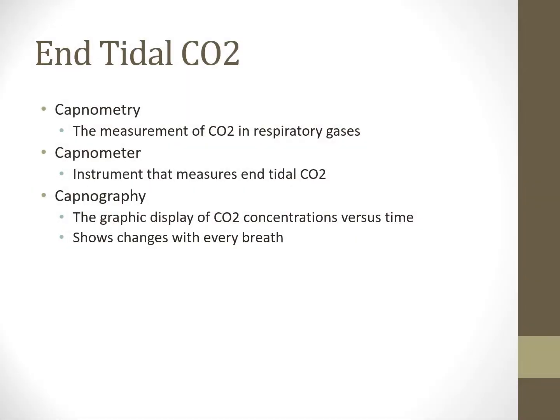Okay, so enough of pulse ox. End-tidal CO2, this is a favorite category of mine. This is a very underutilized and very underrated area of respiratory care. This is a very important area for us to expand and to know what it means. Very few RTs out there understand not only what end-tidal CO2 means to them, but how to use it to benefit their patients more effectively. And so I'm going to preach end-tidal CO2 to you.